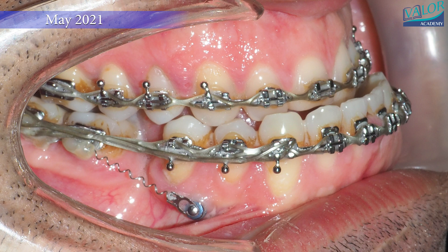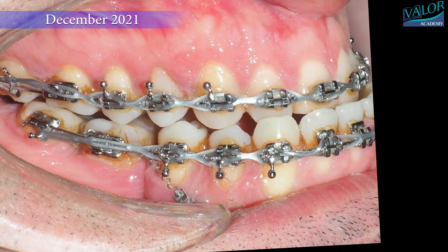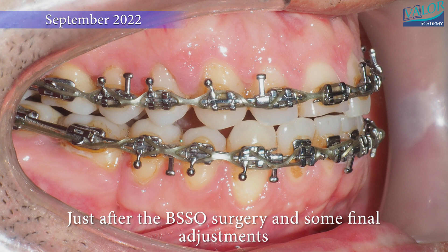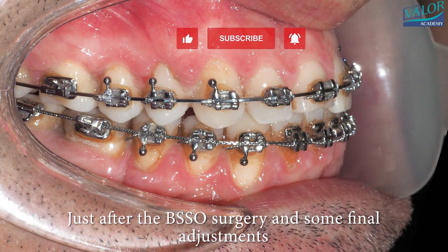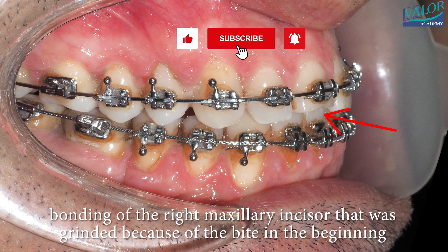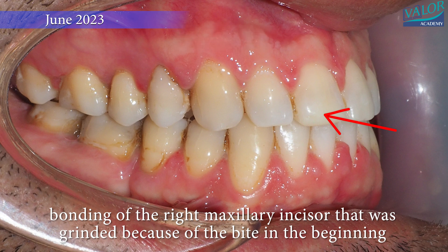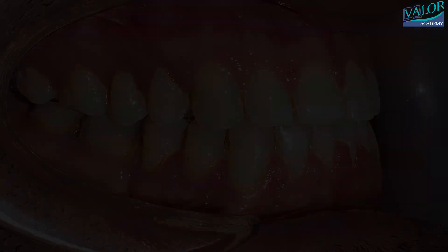After a year, braces were applied to all teeth to prepare for orthognathic surgery. Following bilateral sagittal split osteotomy (BSSO) surgery, the jaw fit properly and the teeth were close to their normal alignment. Final adjustments were made after the mandibular setback surgery, and the braces were removed. The right maxillary incisor, which had been ground down initially due to the bite, was restored.